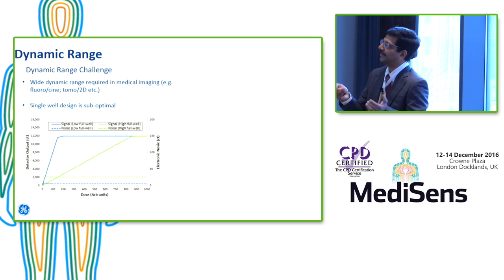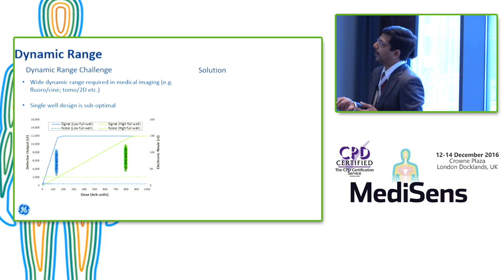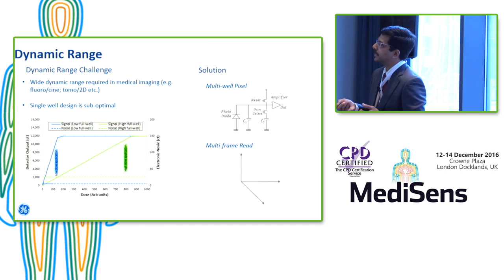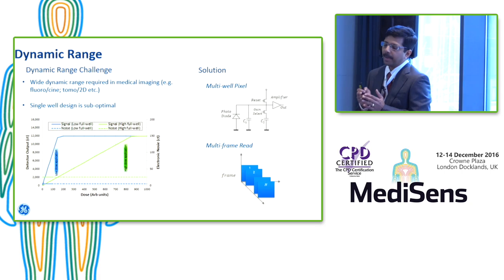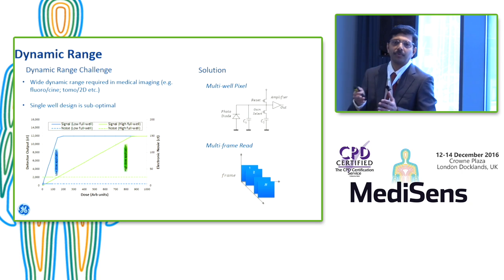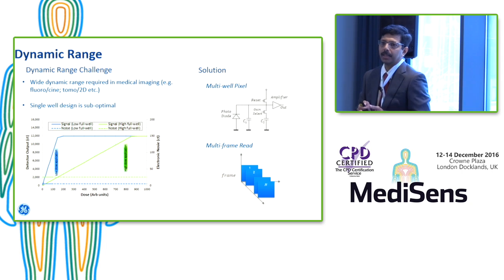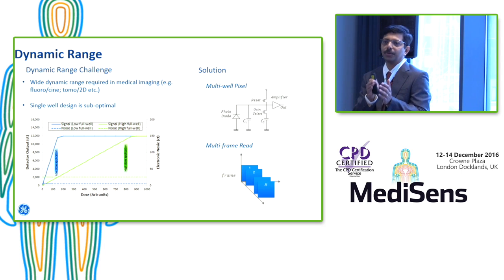Maybe I can skip the dynamic range. We talked about it yesterday. There are ways to deal with the dual well design. But the one thing I point out is that there is an interesting way we can operate the CMOS sensor for applications like mammography. The traditional view is that you design a detector for the highest saturation level. But then we are forced to operate it for tomo, which is like 1/10 of its saturation. So that's definitely suboptimal. The best way is basically to design it for the lowest dose per frame, and then just run it like a fluoroscopy detector.